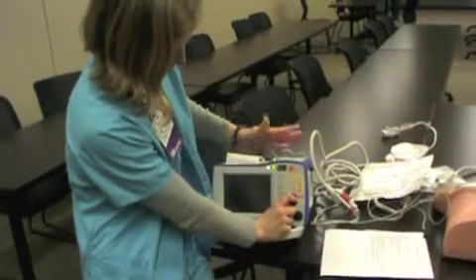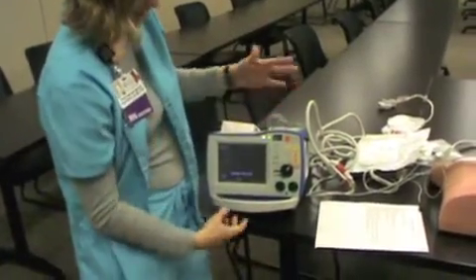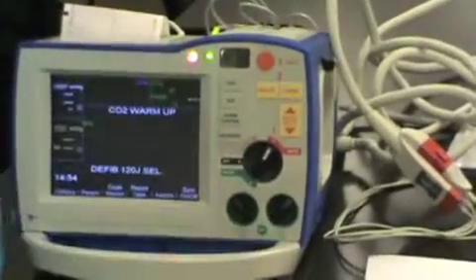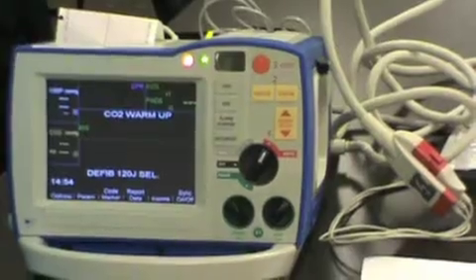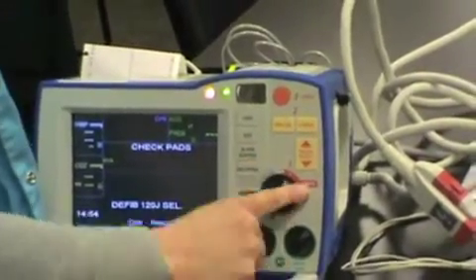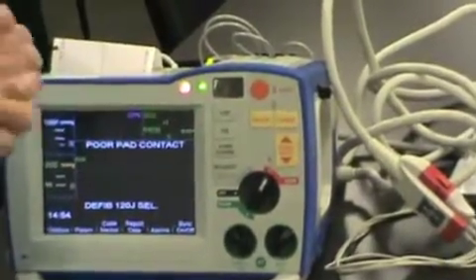Function for us on our defibrillator, of course, is the defib mode. So the defib mode, to use it as an AED, you would just turn that to defib, hit analyze, and listen to the prompts. So just to use it as an AED, your step 1 is defib, step 2 is analyze, and then step 3 is shock if a shock is advised.